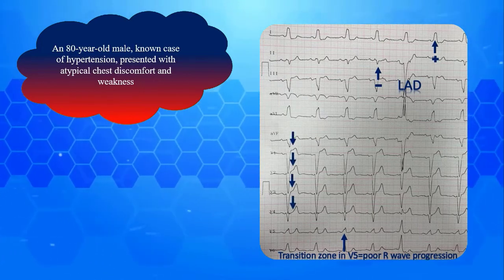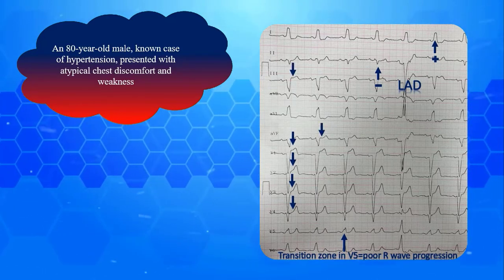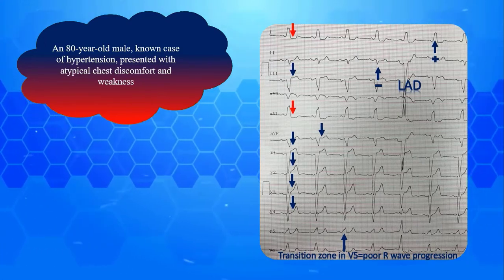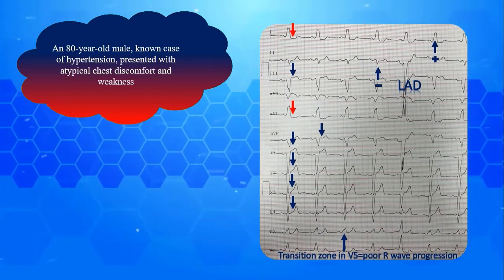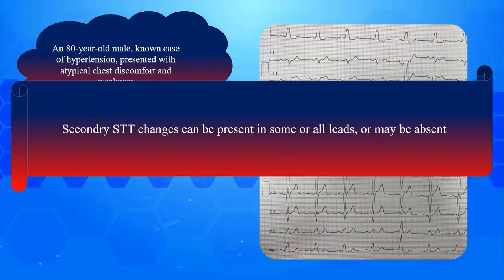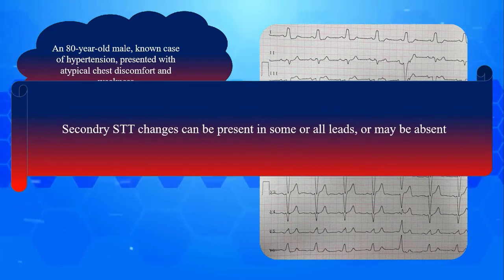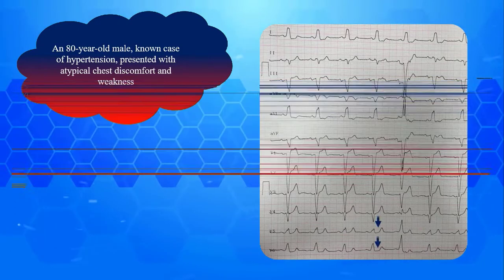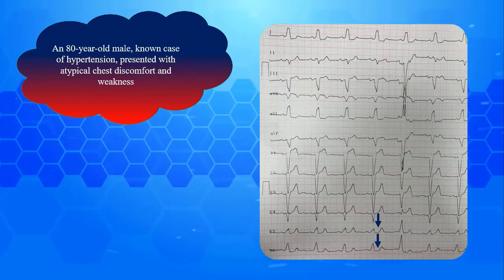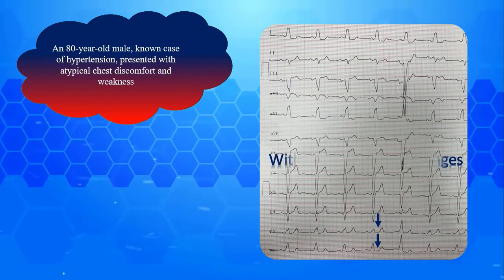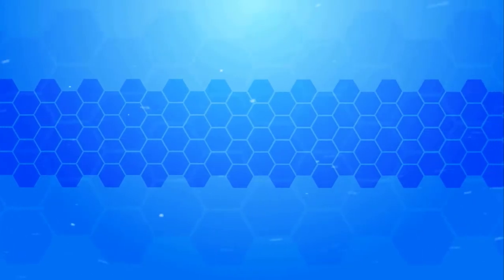There are ST elevations with upright T waves secondary to deep S waves in V1 to V4, D3, and AVF, while there are ST depressions secondary to slurred R wave in D1 and AVL. Therefore the STT changes in this tracing are discordant and considered normal. Recall that secondary STT wave changes in bundle branch blocks are not obligatory — they can be present in some or all leads or may be absent. In spite of tall and slurred R in V5 and V6, no significant ST depression or T wave inversion is present. In summary, this is a typical LBBB with secondary STT wave changes.